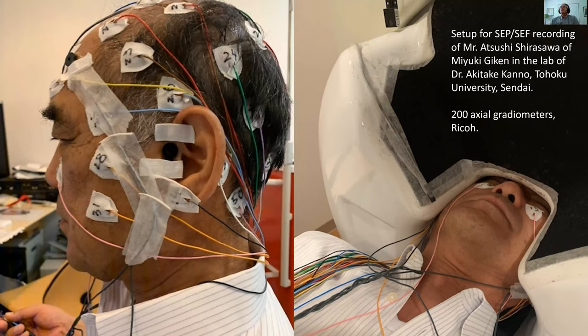The other thing with MEG is the deeper you get, the more the head surface appears to be a sphere from the depths. And the more sphere-like the head is, the more the currents are radial, and MEG doesn't see radial sources. EEG can. So that's another reason why it's sometimes believed that EEG can see deeper sources better than MEG. But ultimately, you want to put them together. And EEG and MEG together could, in principle, and there have been papers on this too, can see more than either one of them alone.